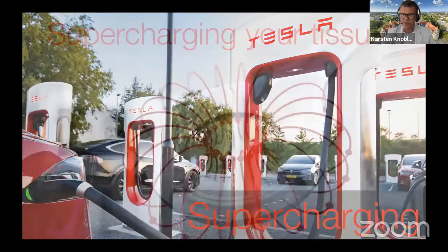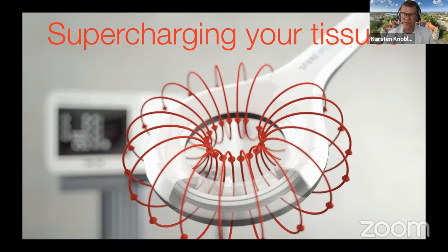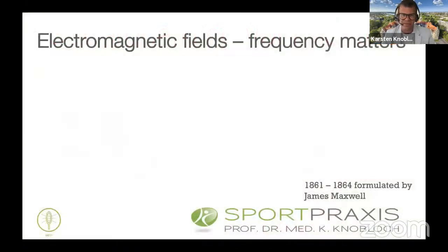And to coin it, how I believe that shockwave and even the novel magnetic field or pulse magnetic field therapies work is that these devices, in a way, supercharge your tissue to achieve higher, let's say, healing capacities.